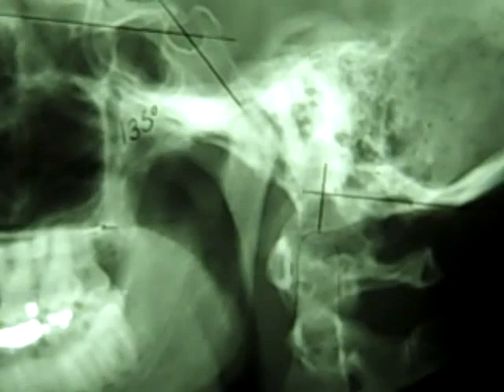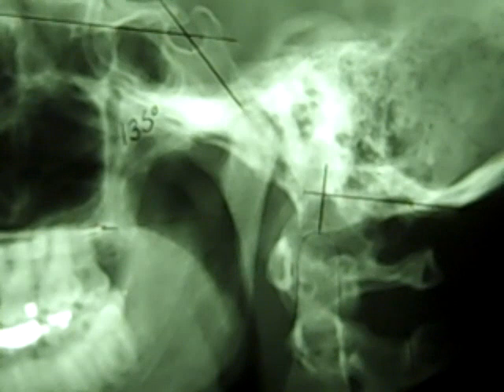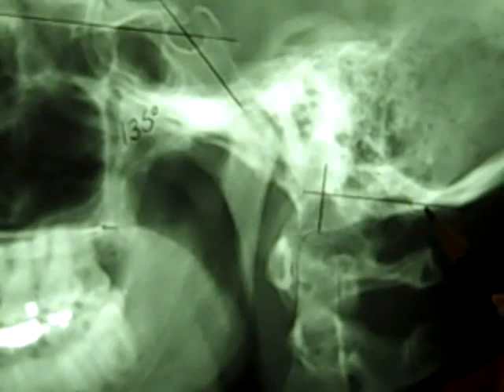If we didn't, remember that the definition of platybasia is a flattening of the sphenoid and/or occiput. This would be where we pick up that flattening of the sphenoid, or more importantly, the flattening of the occiput. Okay, so we're looking to see, is there any bony tissue below the line? And in this case, there is.